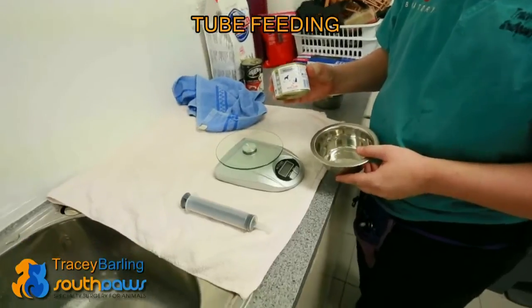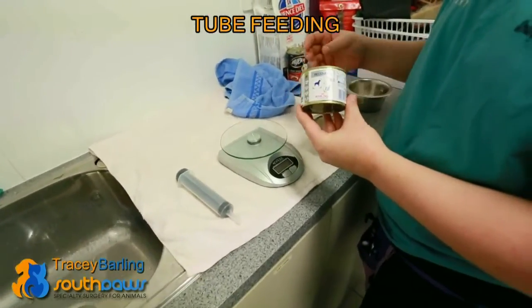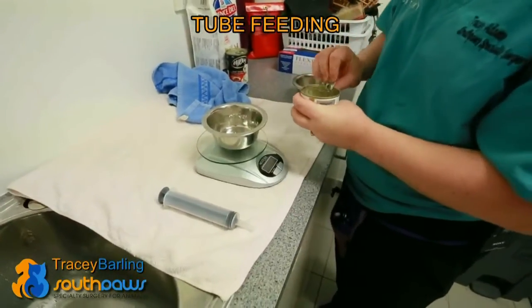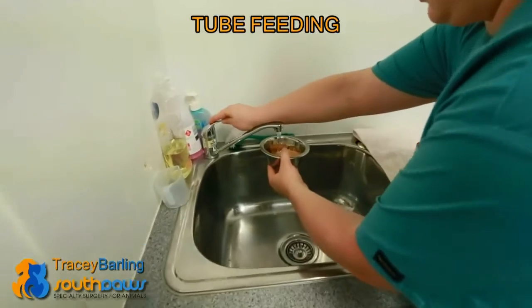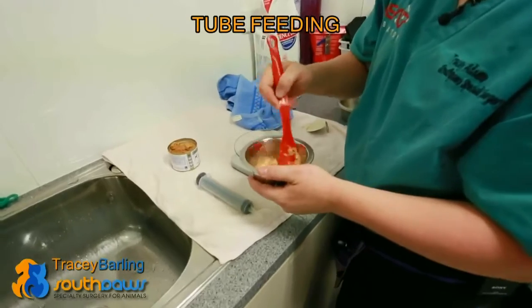It's Recovery — a diet rich in vitamins and minerals for animals that are recovering from surgery. We weigh out how much we want the cat to have per feed, and then we mix water with it and make it into a slurry so that it is capable of going through the feeding tube.